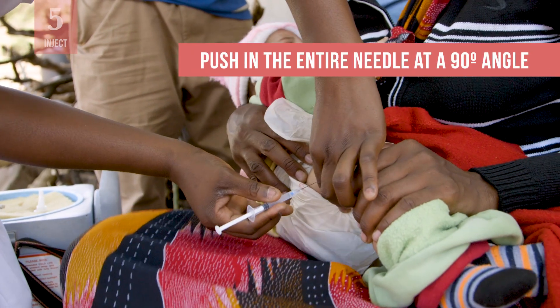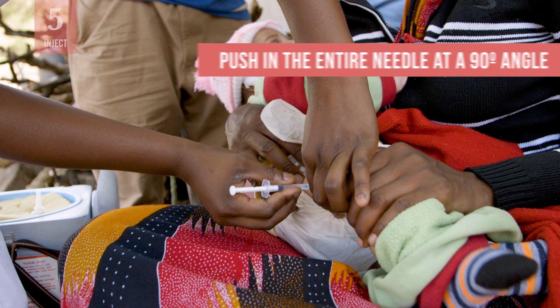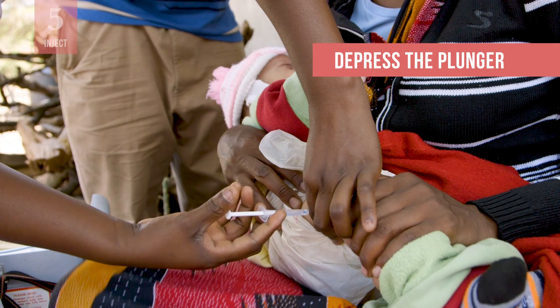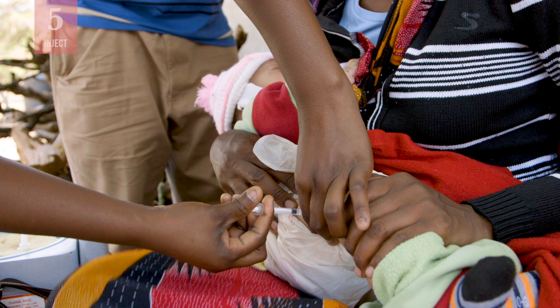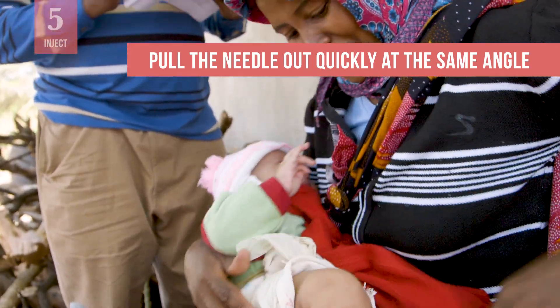Quickly and smoothly push the entire needle into the skin at a 90 degree angle, down through the skin and into the muscle. Depress the plunger smoothly with your thumb. Take care not to move the needle under the skin. Pull the needle out quickly and smoothly at the same angle that it went in.